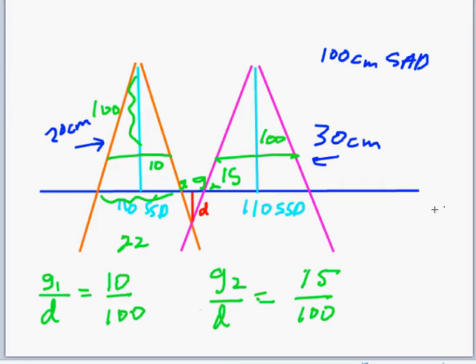And if you remember from a previous problem, we got that our gap was going to be 1.5 cm, so a little bit more if it's defined with the field size at isocenter. So it's important to know that.